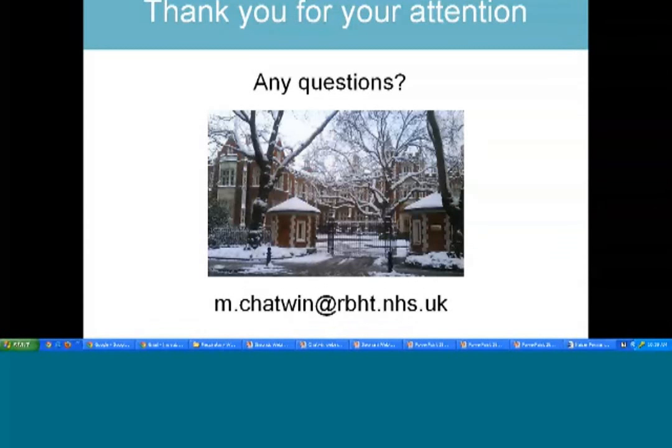And the other thing is you also make sure... Sorry? Yeah, I agree with you. People forget how to do the techniques, the simple things. Seals break, the hose develops a leak. It's nice to know that this is working effectively and you can change things or circuits in a non-emergency situation. You never want to dust it off and say, oops, we need it, but the hose has a leak. It can certainly be very uncomfortable there.